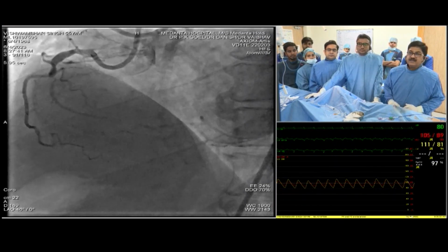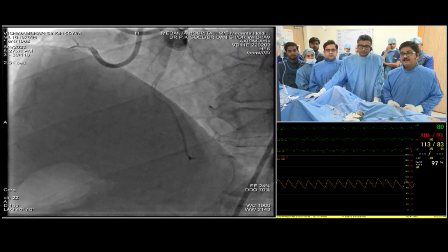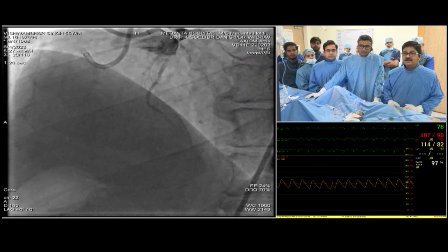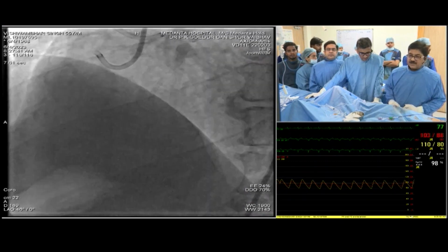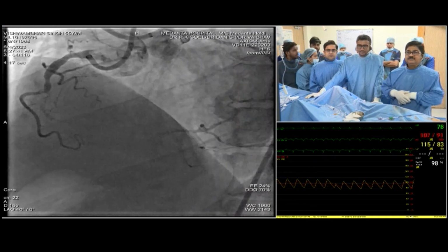Okay, thank you very much for the case presentation, Dr. Goel. And in this time, we would like to discuss the procedure. Do you have some comments from panelists? Dr. Goel, good morning. I'm Dr. Raghav. What I want to ask is, do you think it's a bridging collateral, or is it a vessel which is like that only after that branch?